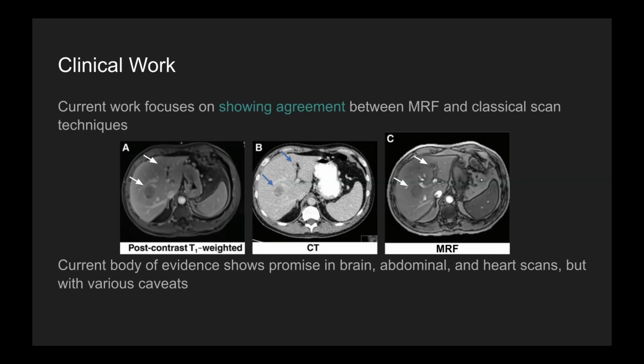So in a lot of cases where traditional MR can be used, MRF can also be used. Next slide.